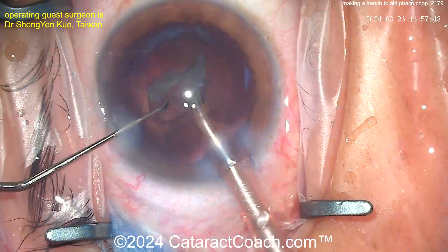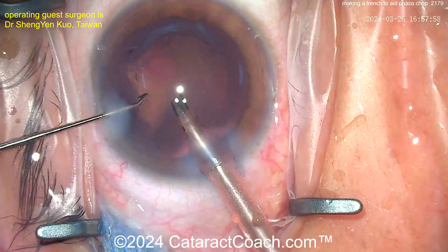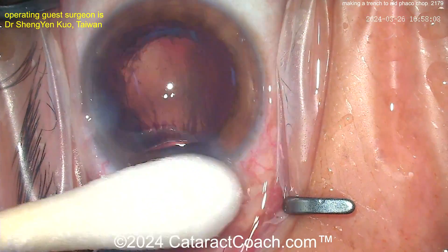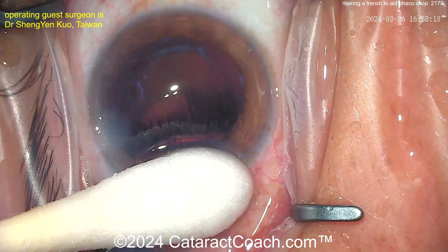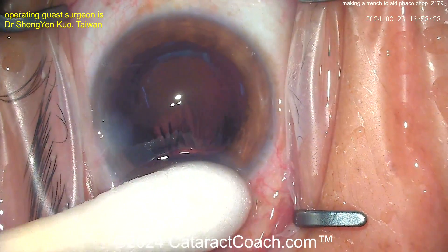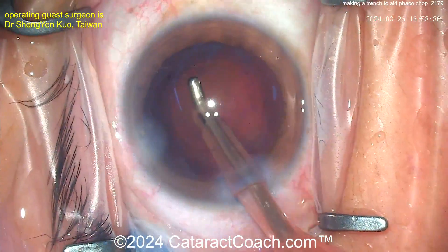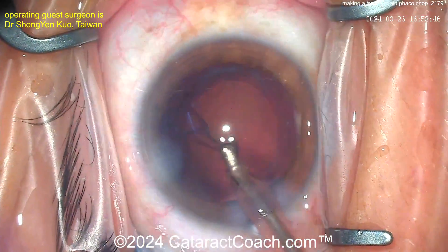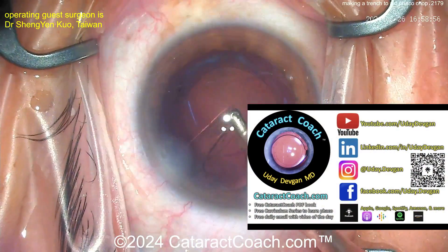I didn't show the very beginning where we did the rhexis — it looks beautiful and perfect. It was actually a manual rhexis, so you can use forceps. Using a little cotton tip there to prevent the AC from deflating, and now going in with the coaxial I/A probe — not a whole lot of cortex left, but a little bit — then getting the lens in.